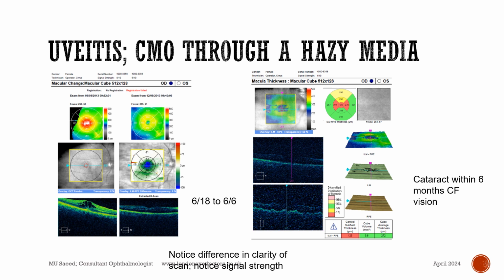In certain types of OCT scans, especially swept source OCTs, the OCT obtained can be of fairly good quality even if there are significant media opacities like cataracts. In other types of OCT scanners, the image quality is significantly degraded if there is a significant amount of cataract.